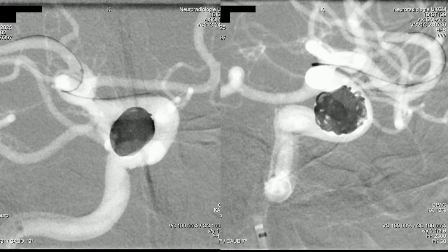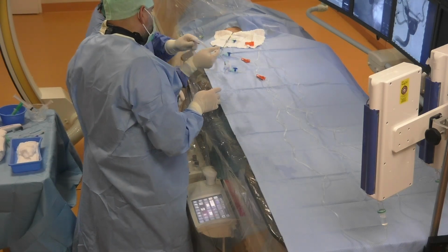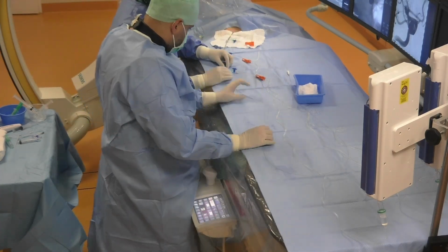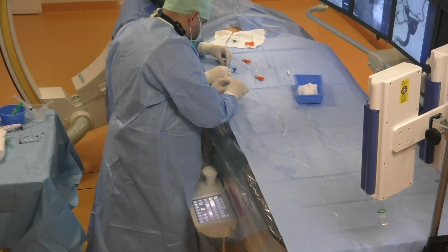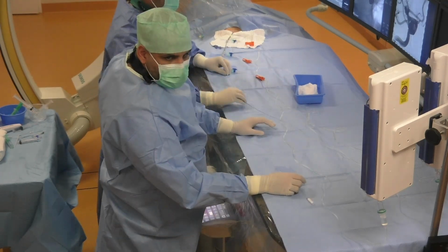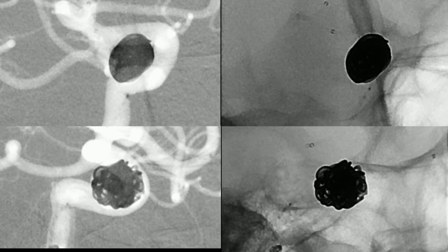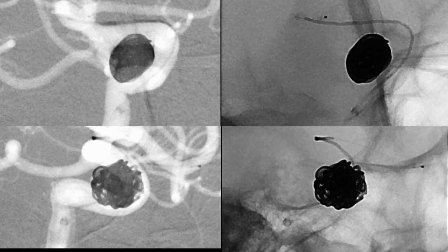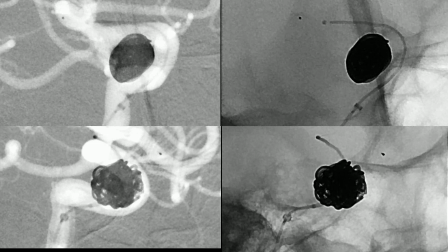And now we can remove the microwire and take our flow diverter, and as mentioned, it is an HPC coated P64, 5 by 18 millimeters. We flush it in the hub of the intermediate catheter, and then we can push the flow diverter inside the microcatheter. And now we can push the flow diverter all along the way through the microcatheter into the MCA, and we pull it back carefully, and when we reach the ICA, we can start unsheathing the flow diverter.